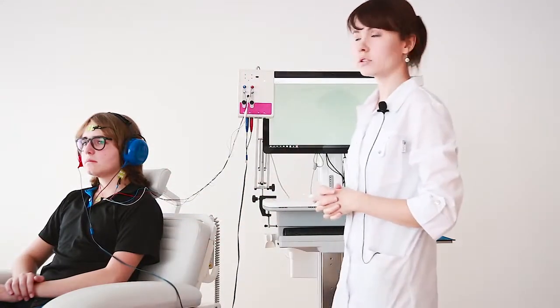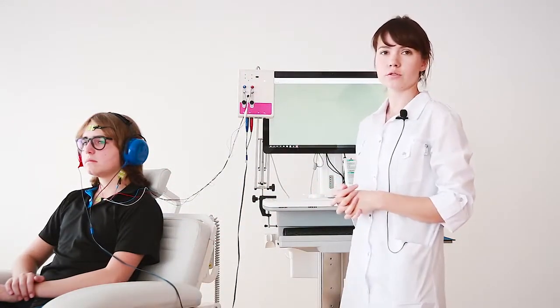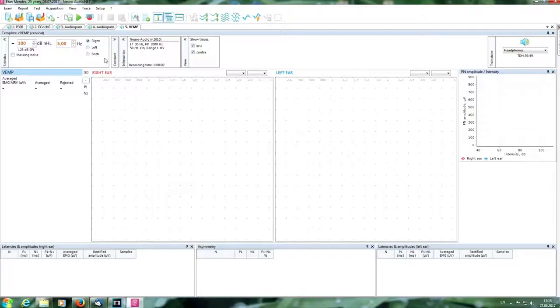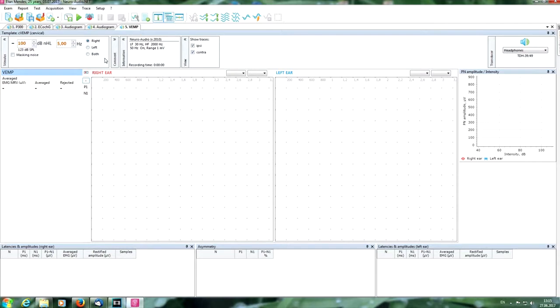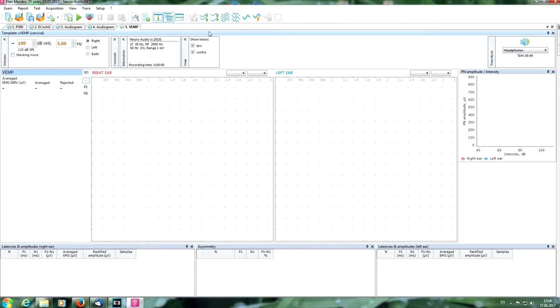Now we can start our work in the near Audio.net program. Now we are in the program window for this test. We can see parameters of stimulation here: intensity, frequency, side of stimulation. Here we can choose the necessary stimulator, for example headphones as today. We can manage the show traces window here. For example, we can switch off contra curves in this test as we don't need them.